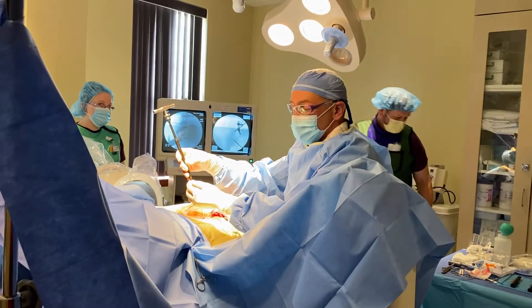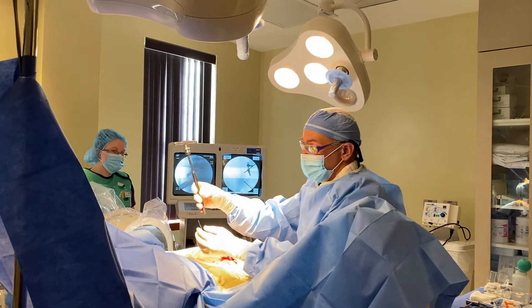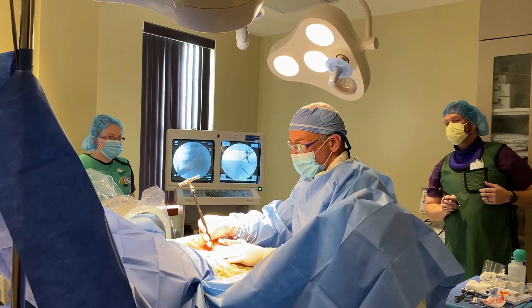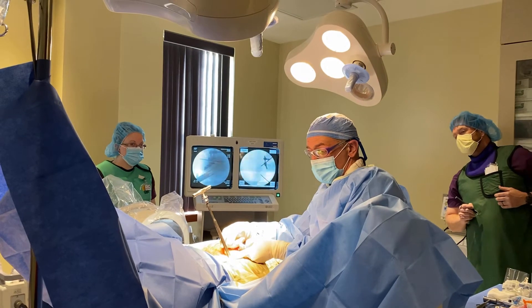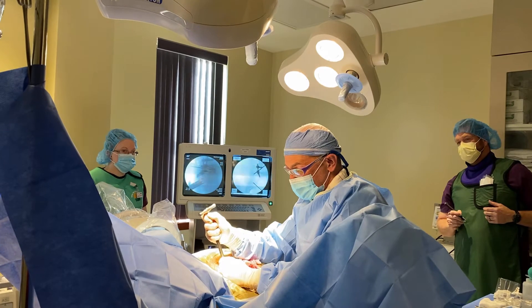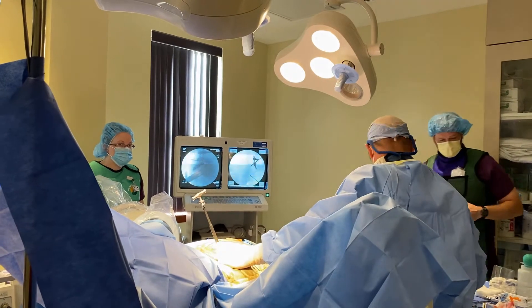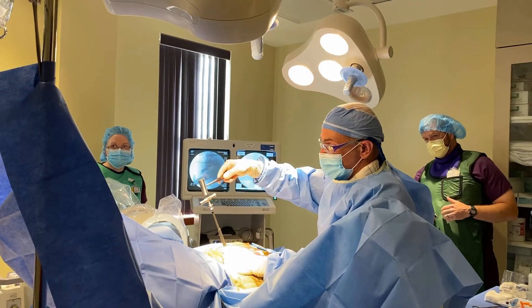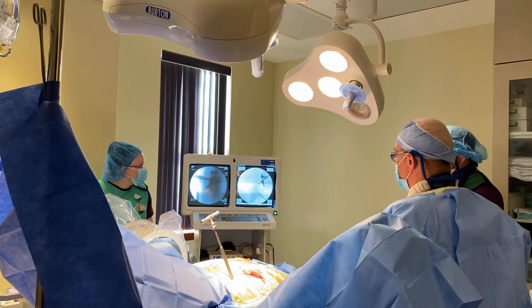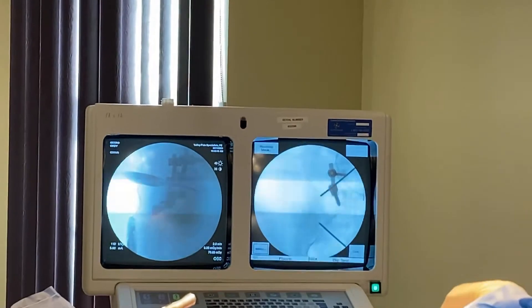We've already deployed the fusion device in the inferior hole. Now we're doing the same thing at the superior pole. This is the guide wire — we'll place it over the joint finder right through the small incision, oriented with the long side laterally, and advance it down. Using fluoroscopy, you can see the joint finder coming in on the top of the screen.